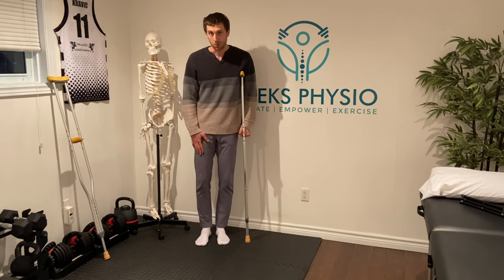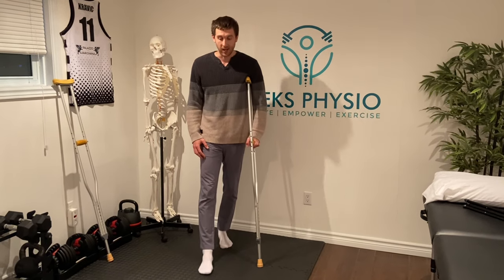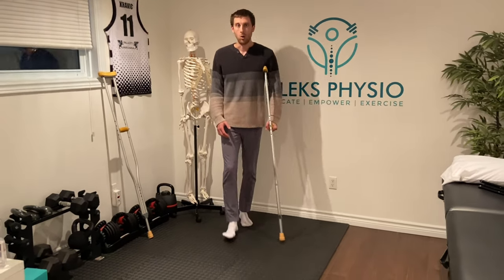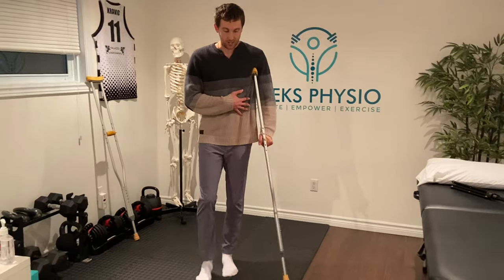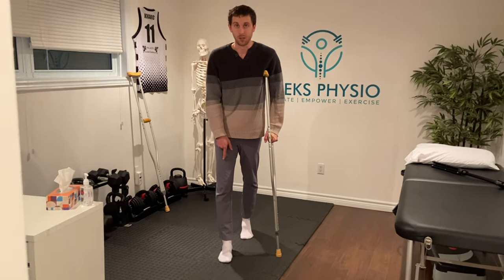As I step with my sore leg — in this case, my right — I'm putting the crutch down at the exact same time. I can either do a step-together pattern for slower walking, or a step-through pattern where this leg comes past, again touching the crutch at the same time the leg comes down.